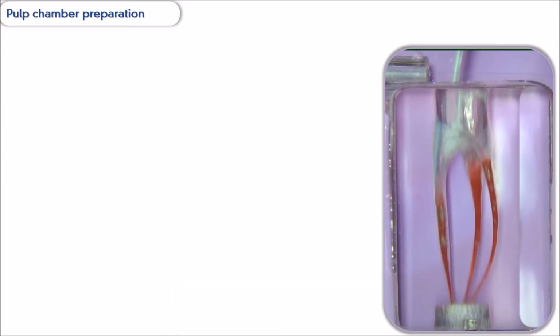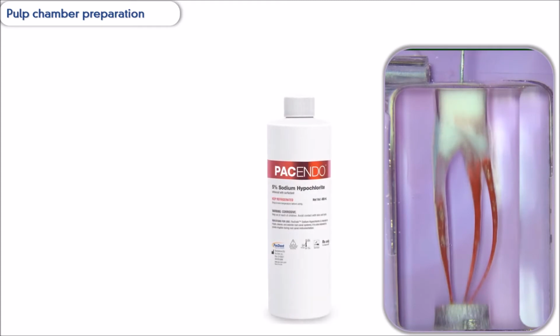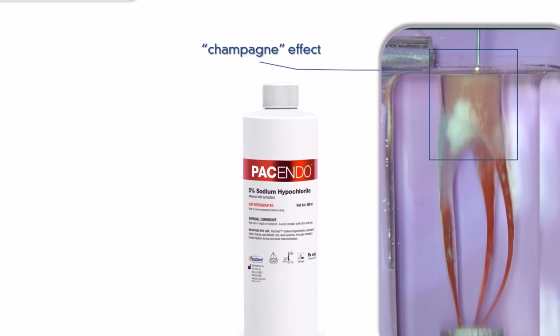With the pulp chamber clean and the canal entrances prepared, we're going to add a lubricant that contains hydrogen peroxide to facilitate the canal's scouting and help with disinfection. Then we pour sodium hypochlorite to start cleaning, disinfecting, and removing organic tissue from the cervical and middle thirds. Note the champagne effect of the chemical reaction between the RC Prime lubricant and sodium hypochlorite.